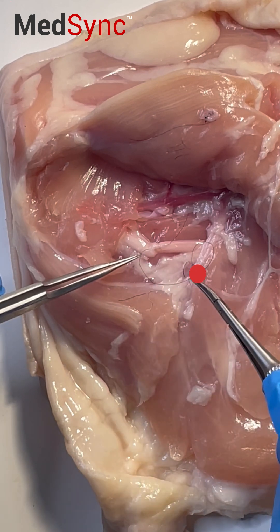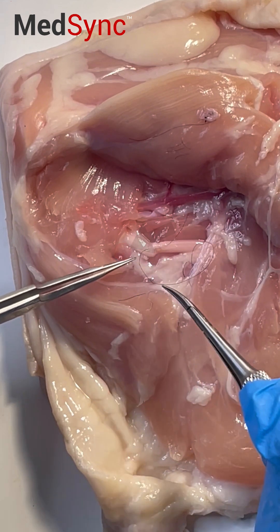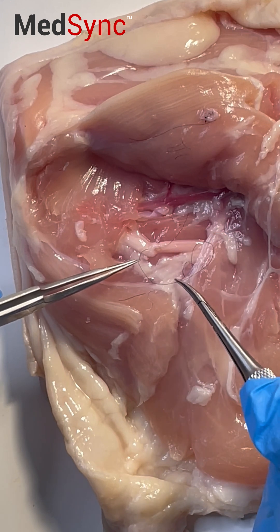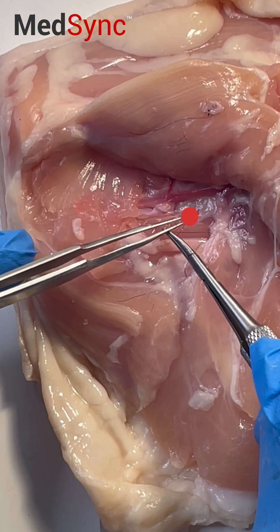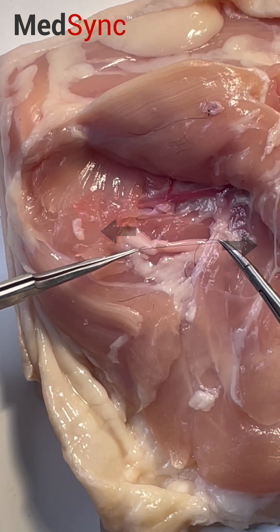So my long suture is here, my short suture is here. This suture needs to end over here and this suture needs to end over here. So I'm going to take the long suture with the needle holder, wrap it around the forcep, grab the tip of the short suture, and pull it through the loop to where it needs to be.